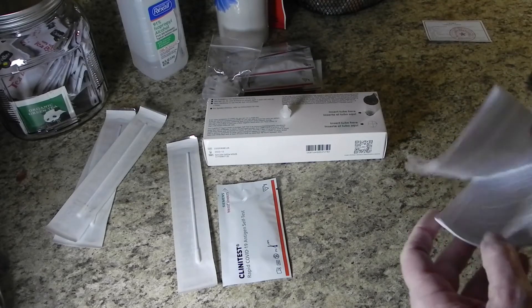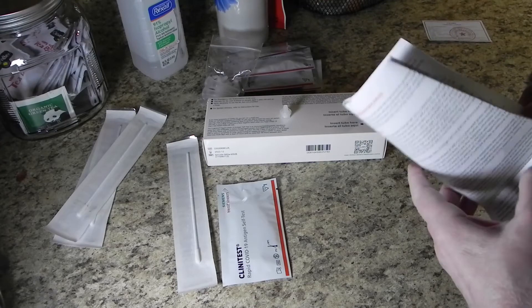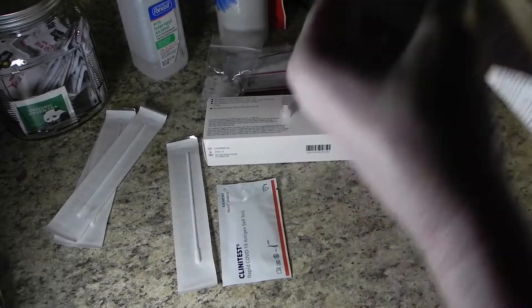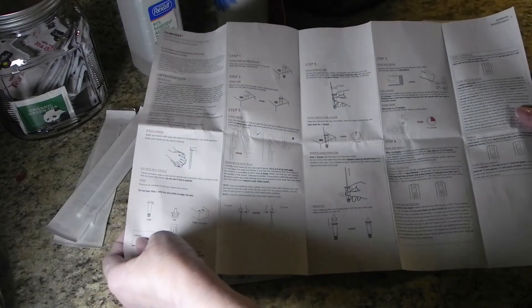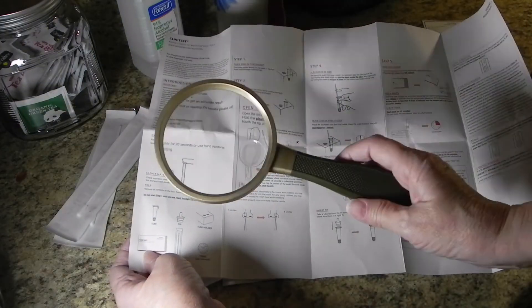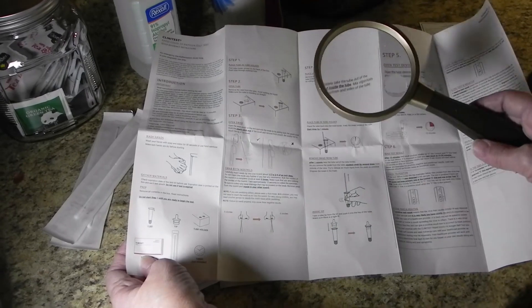Open up your instructions and read through them if you'd like. After getting all your surfaces cleaned and everything laid out, grab a good magnifying glass — you're going to need it.